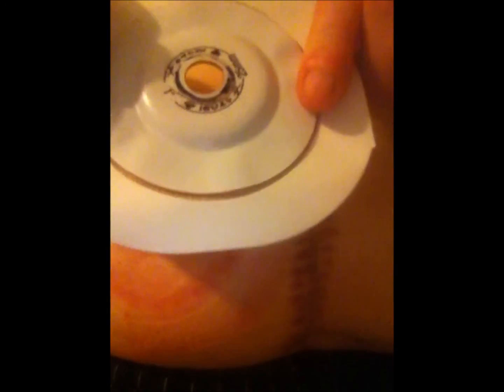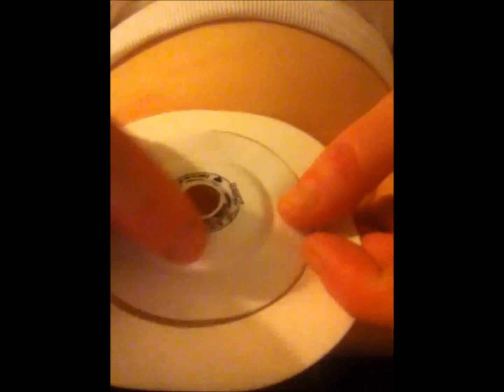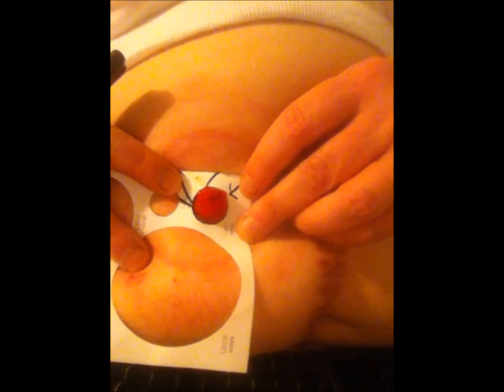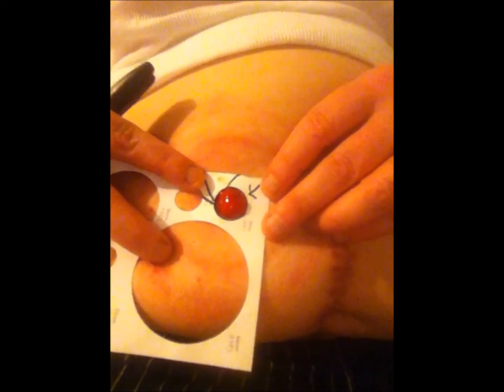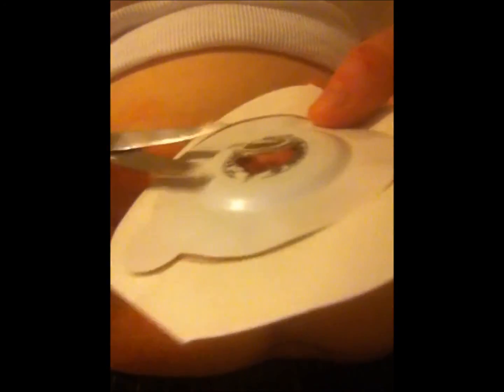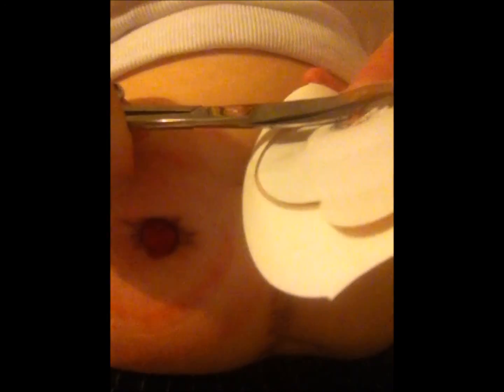So now that I have dried it off and it looks really good, this here is my barrier. This is my wafer, and I used a magic marker. I used my measuring tool to check how big my stoma is, my ostomy, and then I marked it here because they don't come cut to the same size. I've already started to cut it, and I'm going to finish cutting it, and then now I've taken this part off of there and I've made it my size.